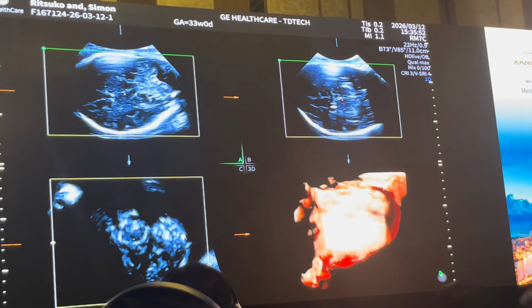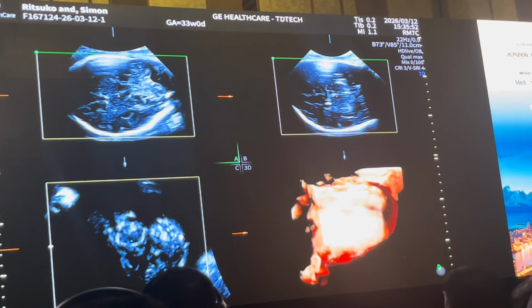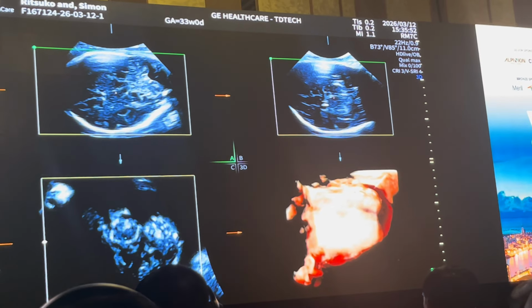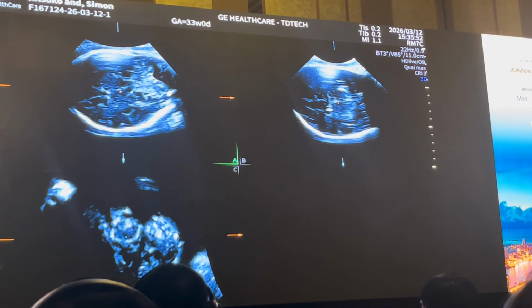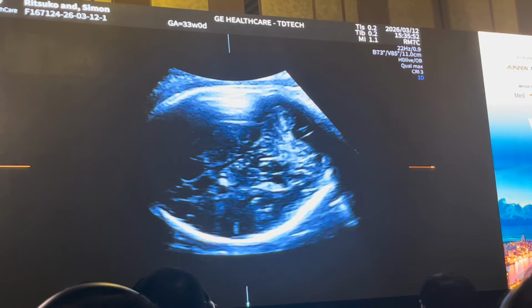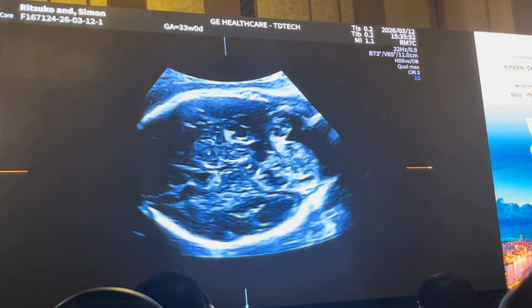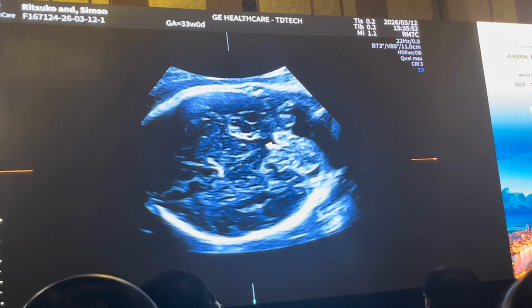6. Okay, good. So now we are left with a multiplanar and render, and I have no interest in the render, so I click the multiplanar. And then once I've got the multiplanar up in view, I then translate through the volume to see did I catch the fourth ventricle. And this is my reference point here, which is my triangle in the fourth ventricle.